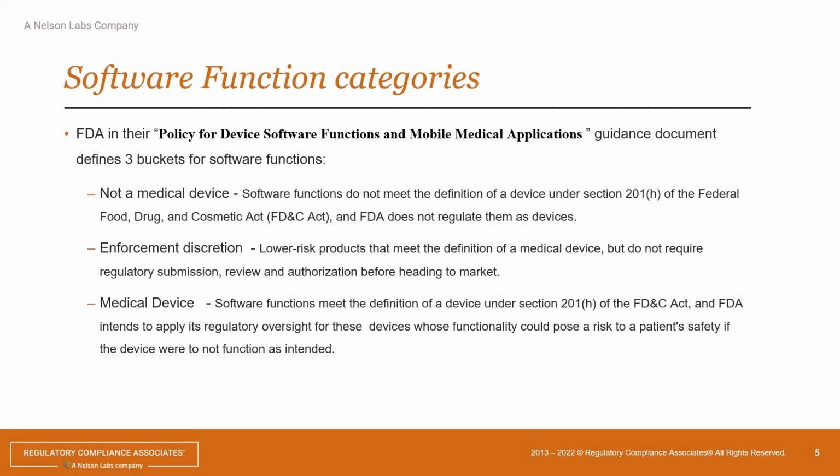Then the middle category is where you do fit the medical device definition, but it's low risk. Let's just say smoking cessation software that motivates people to stop smoking.